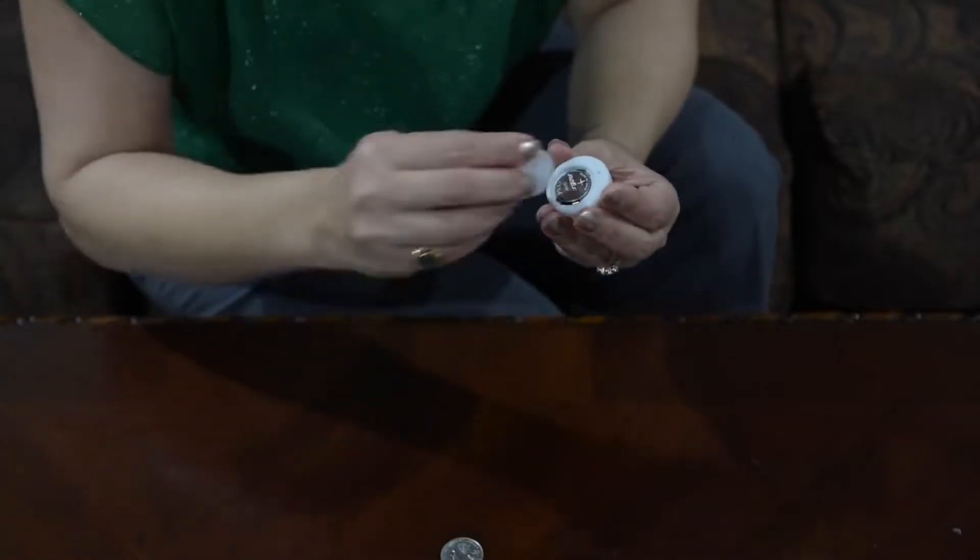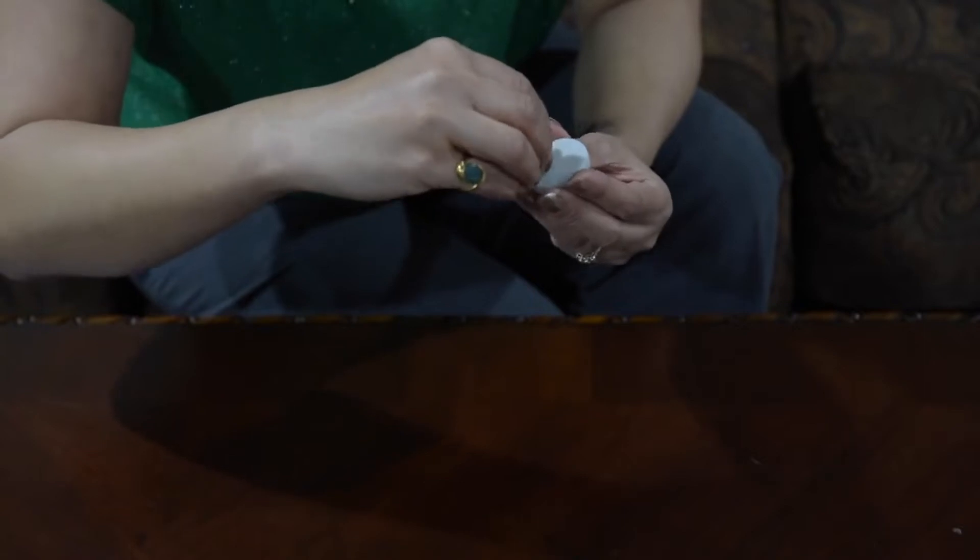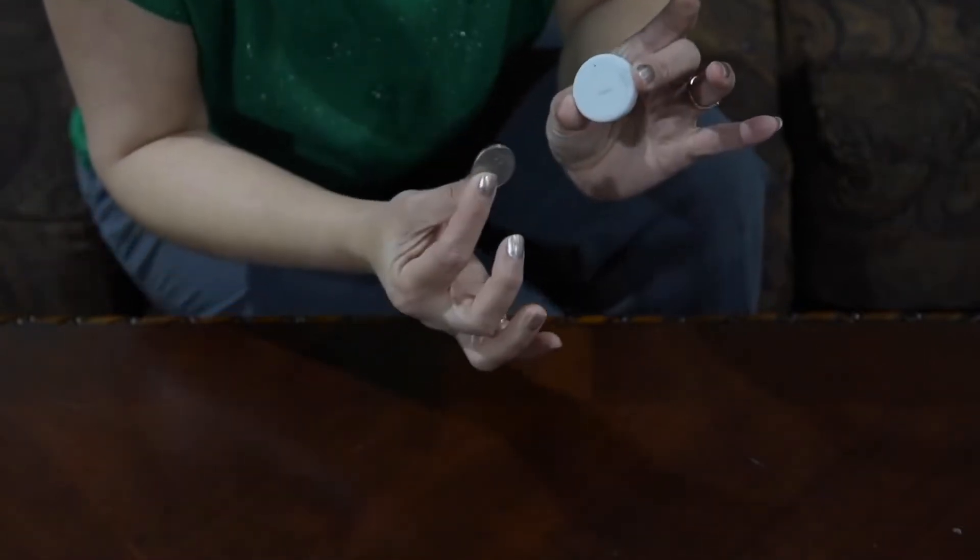Put the battery in there. Then put the cover back and with the help of the coin rotate it clockwise, and you're all set.